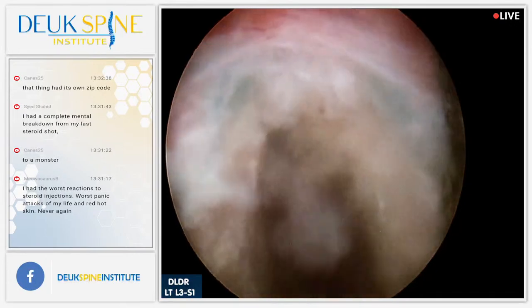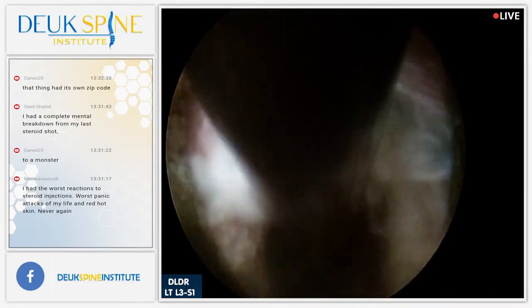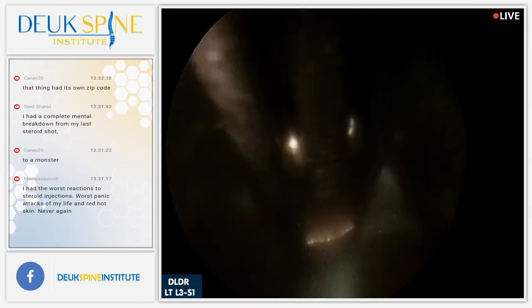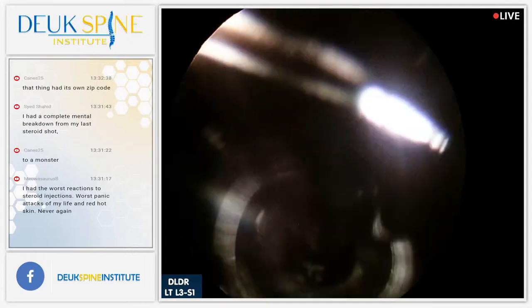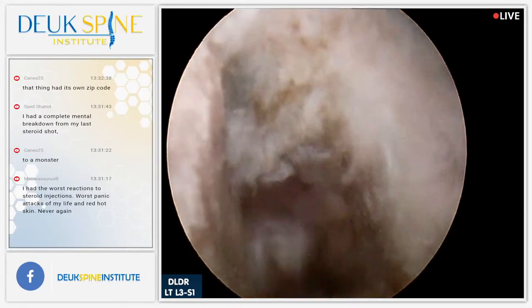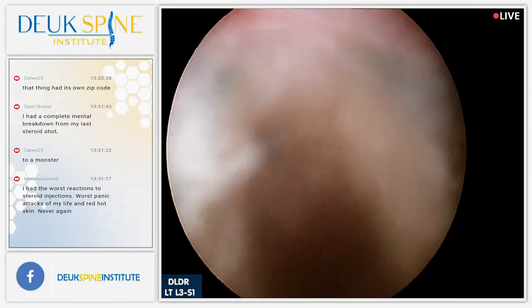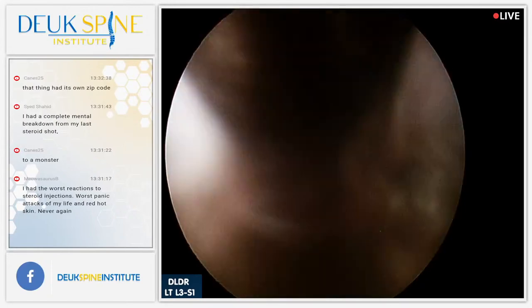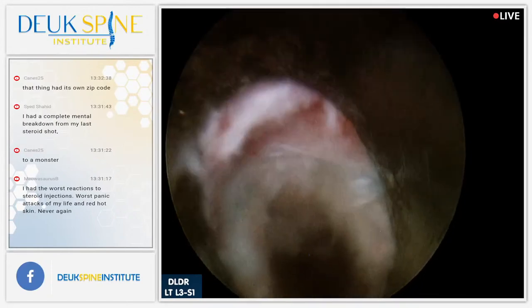All right. So this is a great time to ask questions since we're not using the laser right now. We're kind of in a little bit of a holding pattern while we get some anesthesia stuff taken care of. I'm just pulling out little free fragments that are hanging out. I'm pretty much ready to move on to the next disc shortly. Yeah, I still want to hit that last corner with the laser.